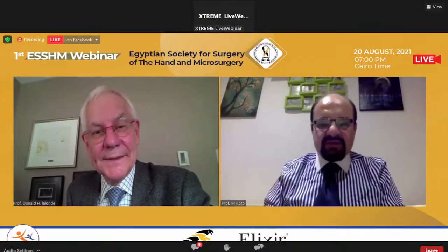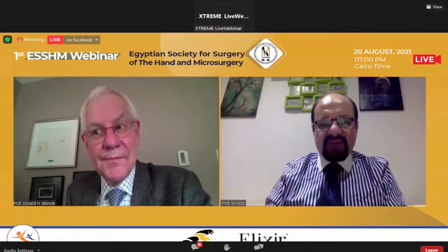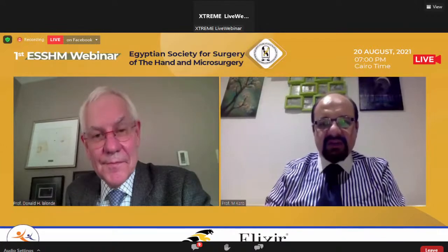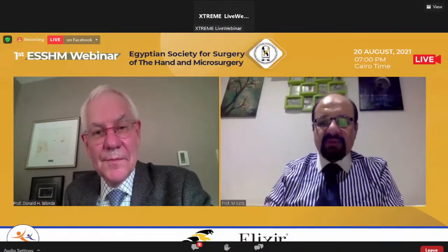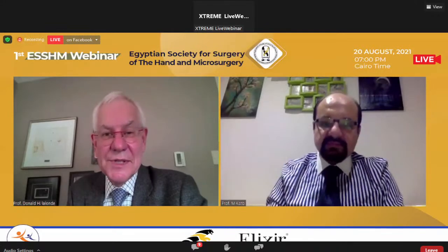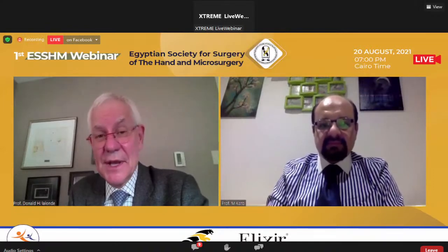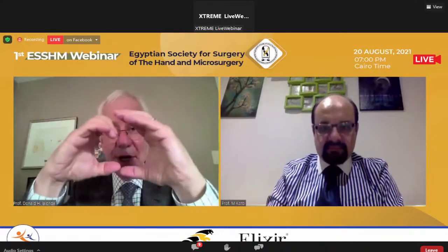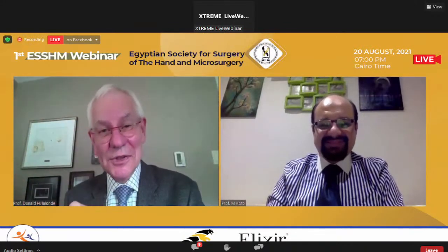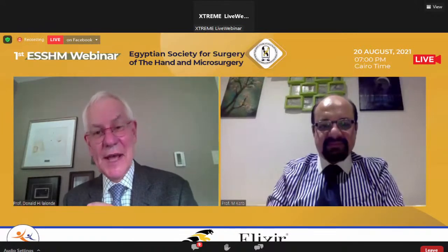Another question regarding the soft tissue defects, traumatic, to use the VAC. Do you use the negative pressure VAC for such soft tissue defects in preparation for a flap or to prepare the wound for a split thickness skin graft? So what is your opinion about using this negative pressure? Yeah, the VAC, or vacuum assisted closure, or negative pressure, I love it. As a plastic surgeon, it takes big holes and makes them little holes. And then you can close the little holes with WALANT with stitches. Whereas before we used to use skin grafts and flaps and all that.